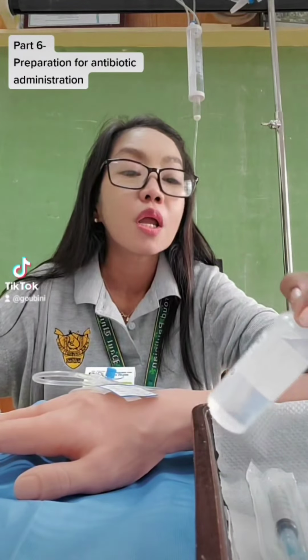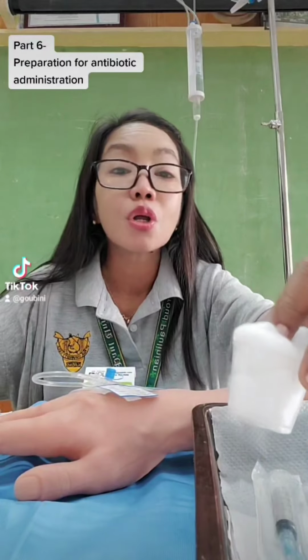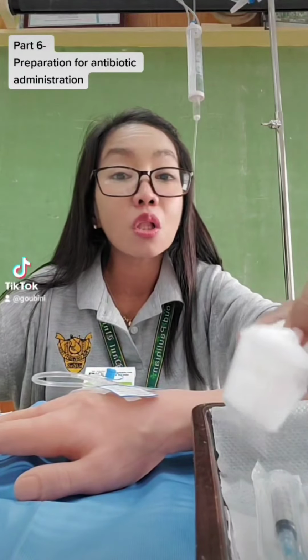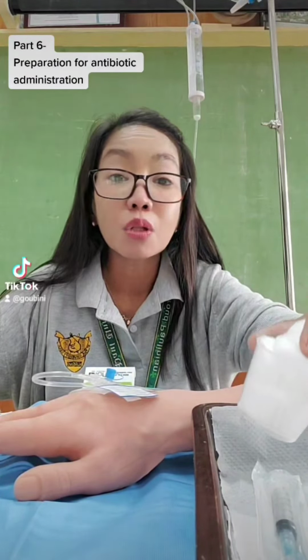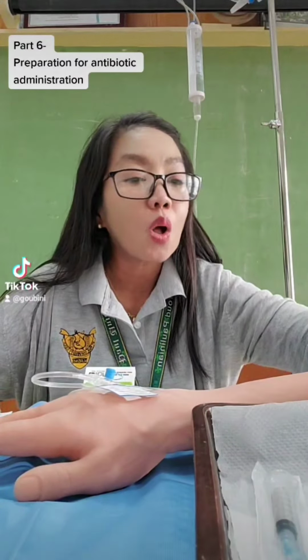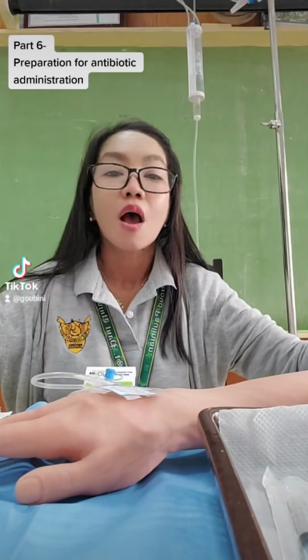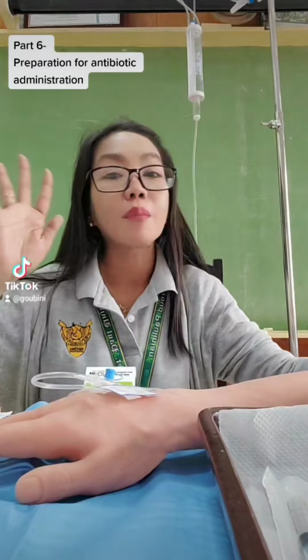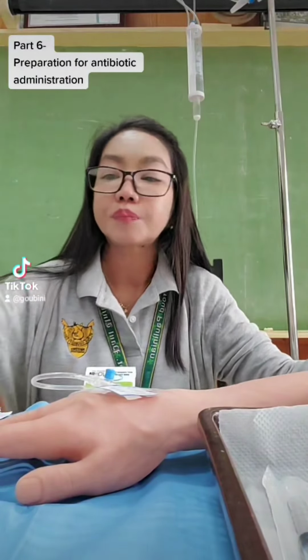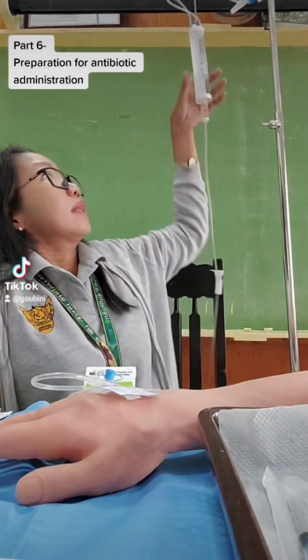You need your plain NSS or your sterile water to dilute the powder form into liquid form. And then you need your cotton swab with alcohol, or cotton balls soaked in alcohol to disinfect. You also need a medication tray. So right now we are in the nurse's station where medications are being prepared.